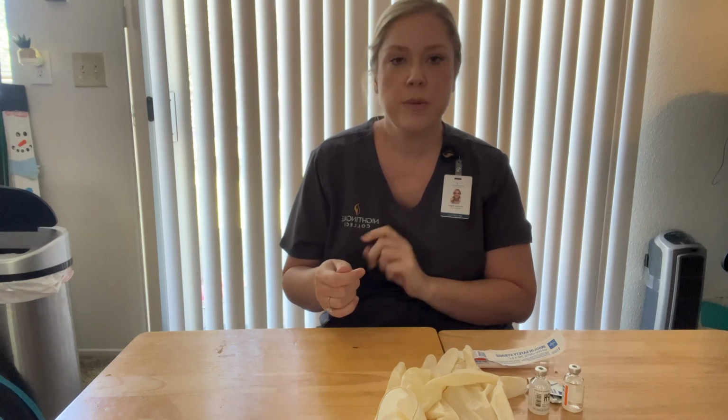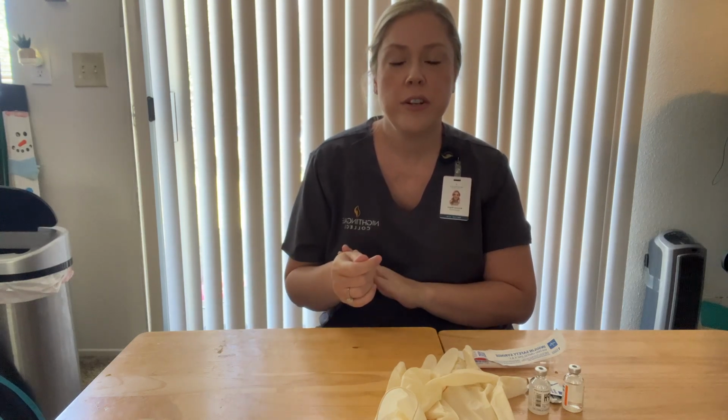I would enter the patient's room, close the door for the patient's privacy, and wash my hands. Hi, Mr. Smith. My name is Christina. I'll be your nurse today. Can you please verify your name and date of birth? Check his wristband while he's verbally verifying, for 2 verifications. Perfect. Mr. Smith, do you have any allergies to any medication, environment, or food?